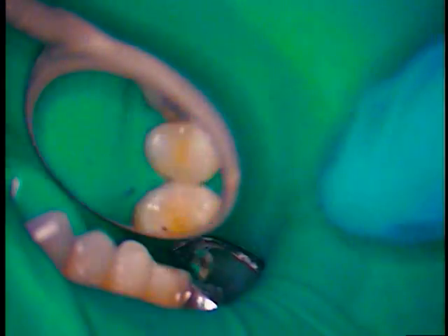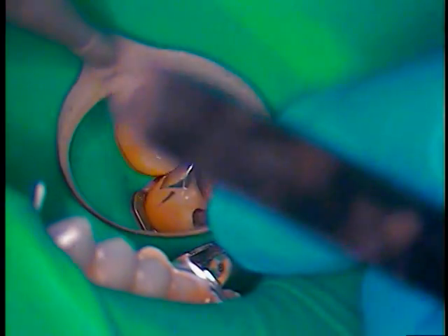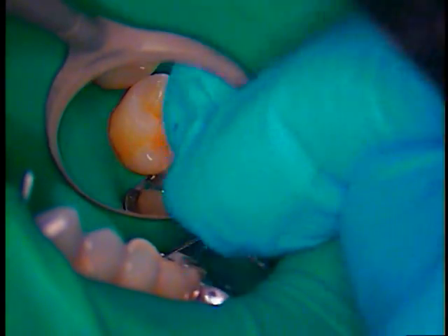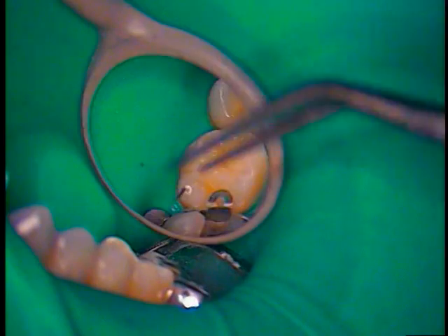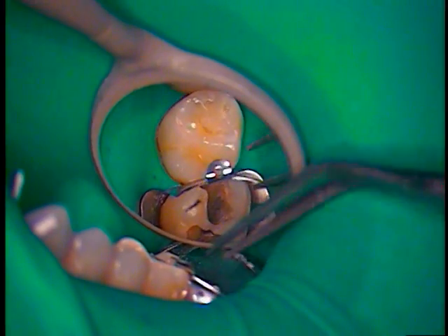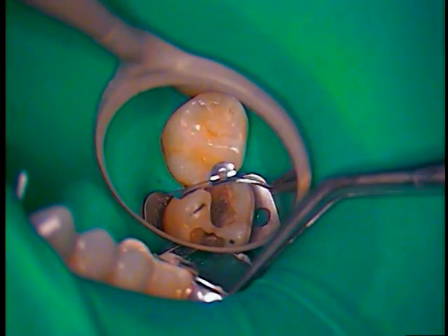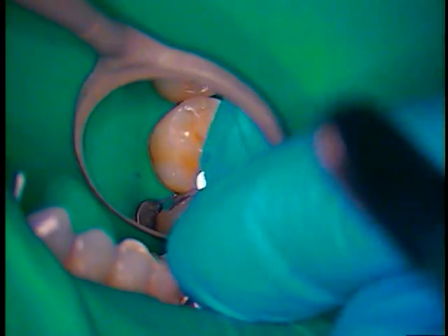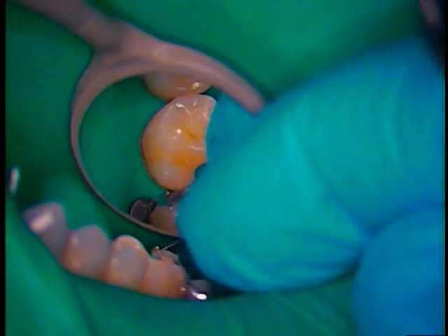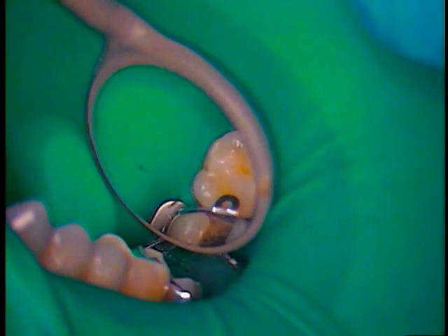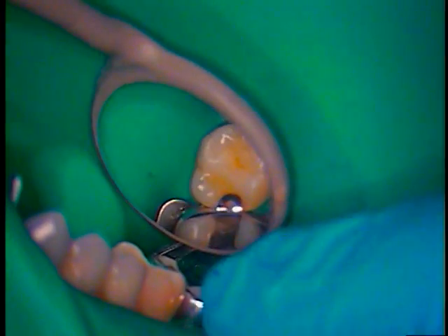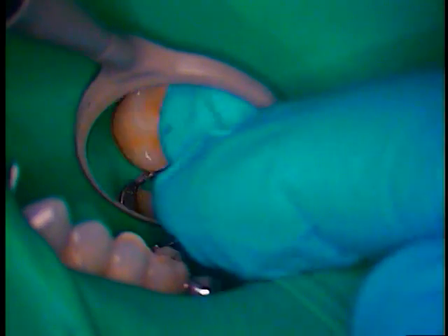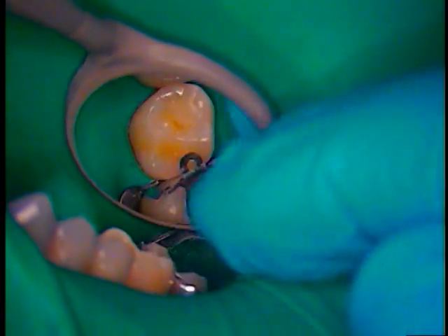Bring in my... slide it in. That's the band, it's cooperating good. There we go, slide it over. Okay, it's pretty decent.